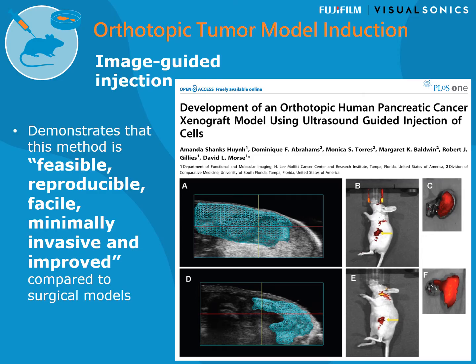In this paper, researchers show how complementary high-frequency ultrasound imaging and optical imaging can be. Bioluminescence and fluorescence techniques are very sensitive. You can really detect tumor cells in a cluster deep in the tissues. However, the light is highly scattered when diffusing into the animal body, and there's a real lack of resolution. So when combining both techniques and using our high-frequency ultrasound transducers, you can really see where the tumor is in the animal body, how deep it is, if there's one or multiple tumor spots, or eventually metastasis surrounding the primary tumor, and then you can get the tumor volume calculation.